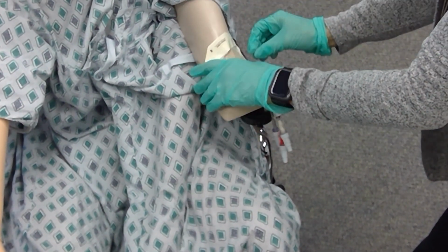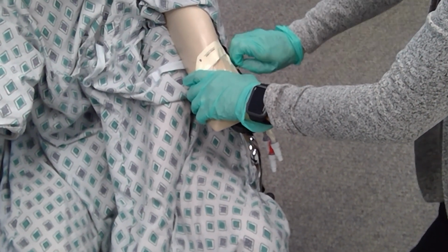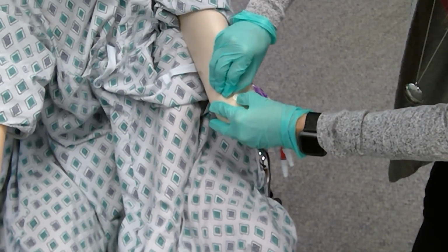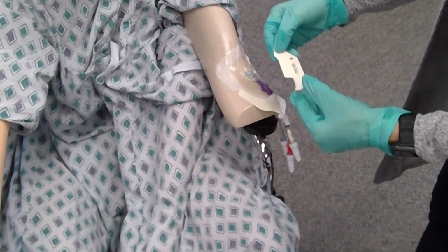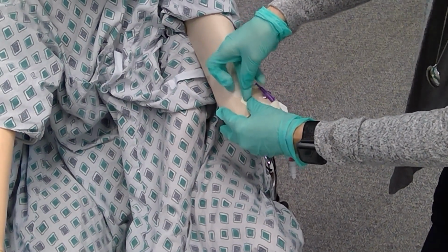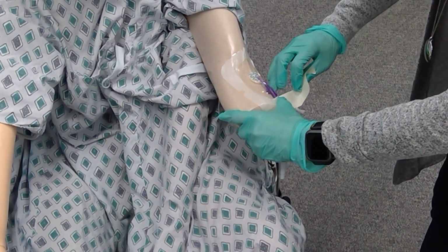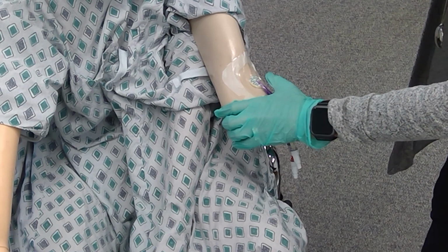Press all the areas down, and then the outside piece comes off. Make sure you save that part, because that's where you're going to put your name and the date that you did the dressing. I want to make sure that everything is pressed down.